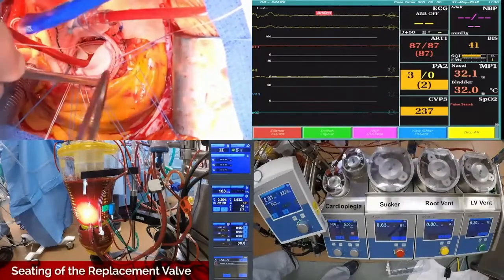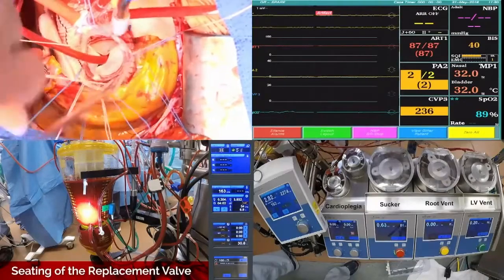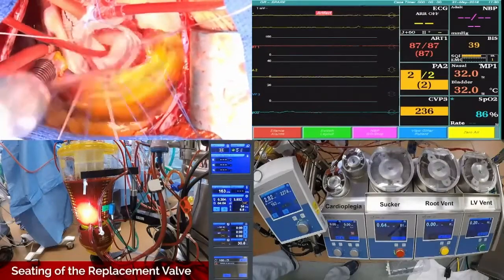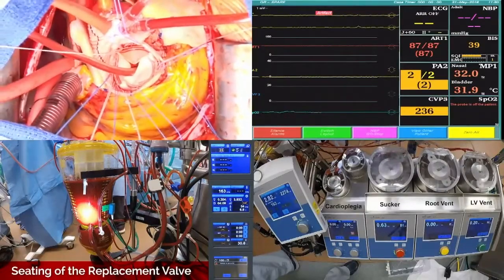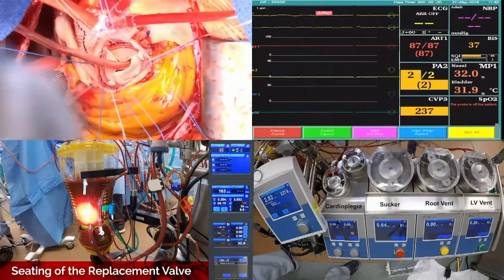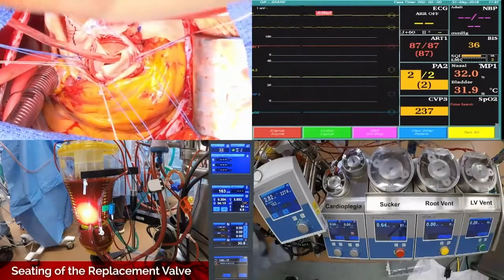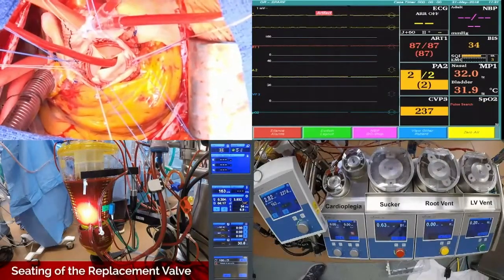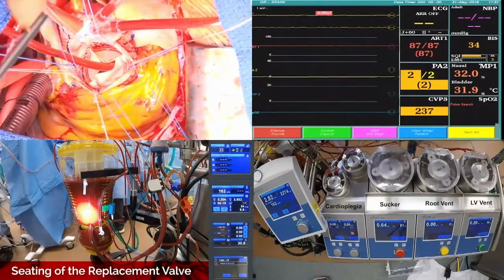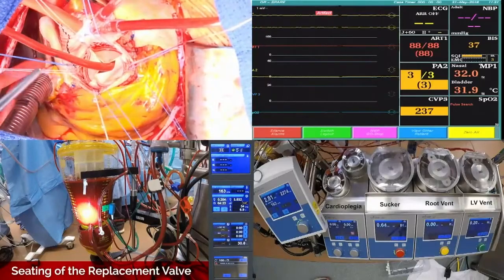How many knots is it? Eight? Well, if you've got a small annulus and big hands, sticking your big digits down there risks tearing the aorta. It's eight knots all the time. No, 21 and below, eight knots. When you tie, it's at least eight, and that's to lock it. If it's Tycron, you can do five. If it's Ethibond, you need to do at least eight because it slips.